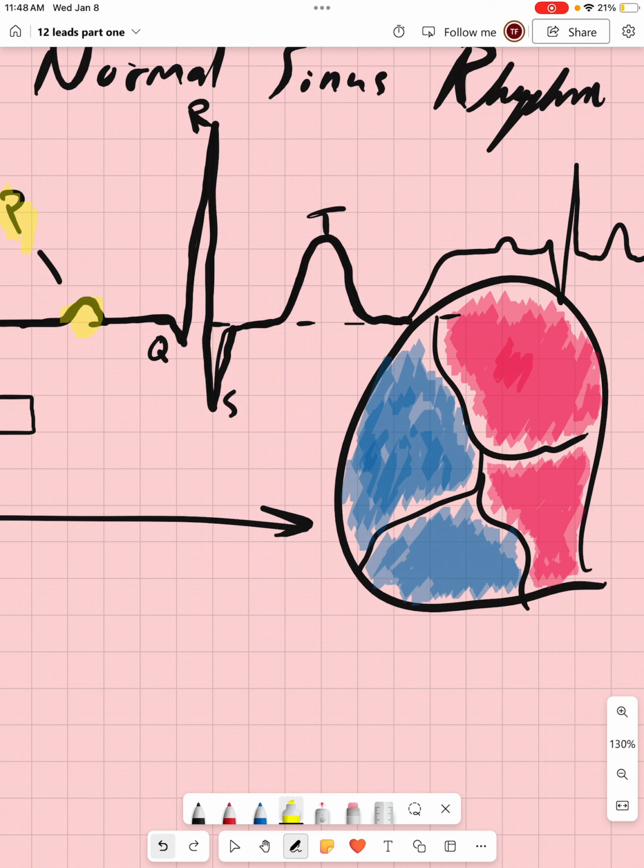Okay. Now, the QRS complex is referred to as a complex because the waves are viewed together. It is one wave that is comprised of three smaller waves, but it indicates one specific thing, so that's why it's grouped together. The QRS complex signifies the electrical depolarization of our ventricles. Now, if you might recall, before I talked about how the left ventricle specifically, again, I might as well just label these.